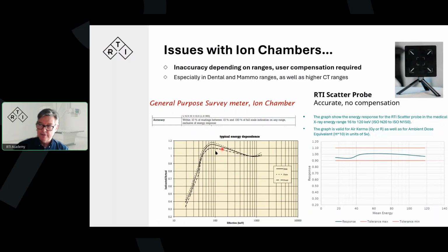So this is one of the explanations why there may be differences in the readings here. And we're very humble. We know that the reference values many times are based on ion chamber based survey meters. So it needs some discussion, some understanding, some evaluation of the situation. What was actually done before, and how does that match the values that we're producing today?